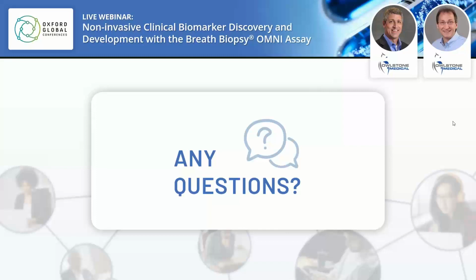Ultimately, though, I think concern about diet would only be a problem if you would expect there to be systematic differences in diet between the groups of interest. So if the healthy controls were on one type of diet and a disease population was on a different diet, then that would clearly have some impact on the markers you would detect. And I think the last point to make on that is that we do collect information related to the time since last eating as part of the CRF.